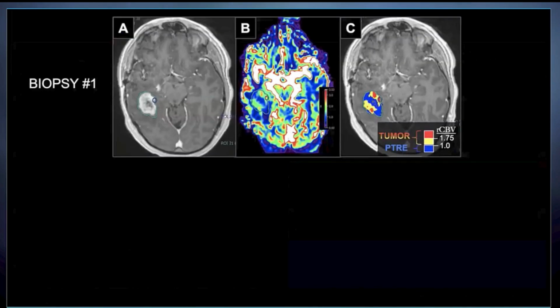And so this is another case to illustrate this. This was actually a tumor board case that we encountered where the neurosurgeons took a couple different biopsies from the same enhancing lesion. Here we see the post-GAD MRI shows this enhancing lesion concerning for tumor recurrence. Patient was taken to surgery and a biopsy specimen was obtained along the medial aspect during the course of surgical resection, but they submitted a biopsy specimen from the medial and anterior aspect of the enhancing lesion.